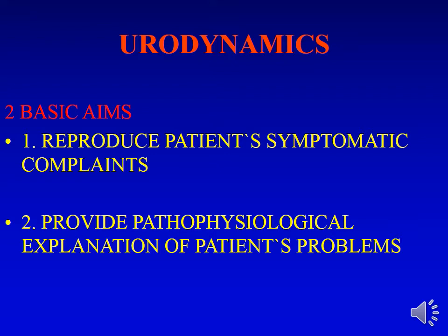Now, what's the basic aim of doing a urodynamic? Actually, there are two basic aims. When a patient comes with urinary problems which cannot be solved, first and foremost, we need to do a urodynamic to find out exactly what's happening. Now, urodynamic is not like an ECG. It's not only about tracing. We have to ensure that we manage to reproduce the patient's same symptomatic complaints.